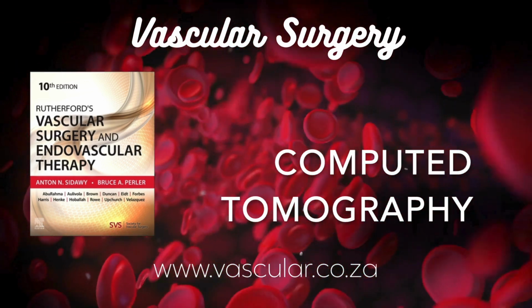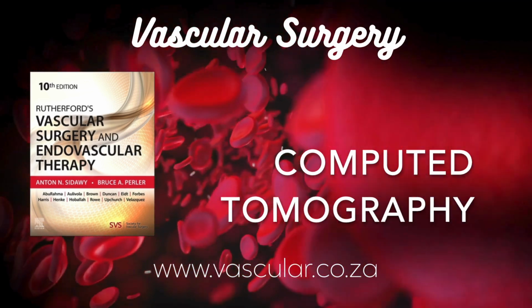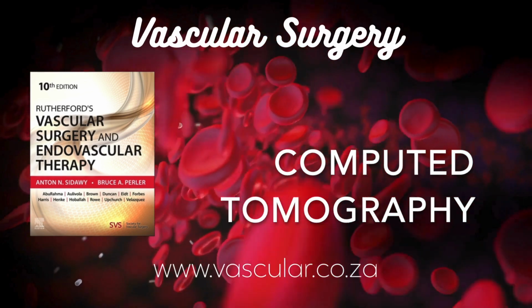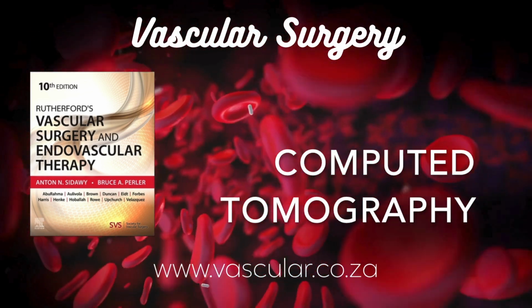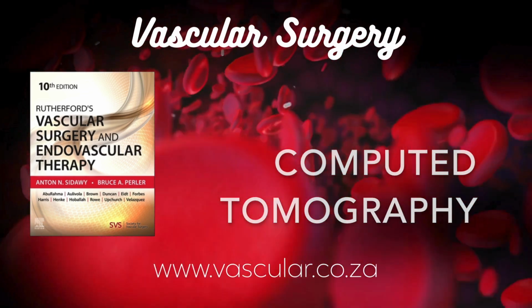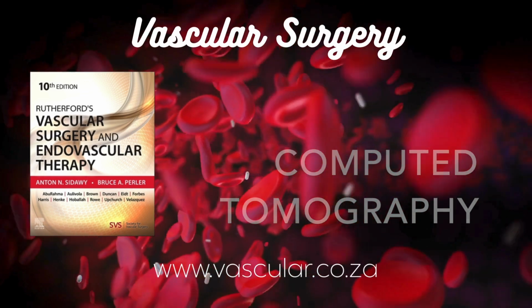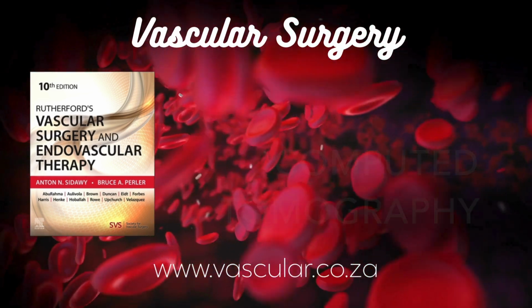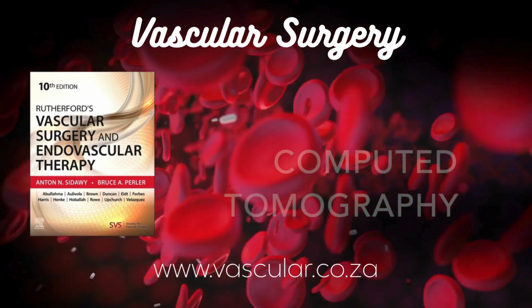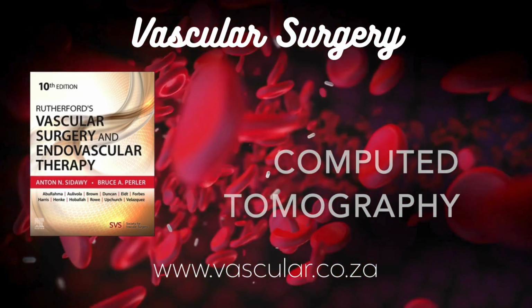Right. The key is injecting an intravenous contrast agent, usually containing iodine. Iodine is very dense to X-rays. So it makes the blood much brighter on the scan. Exactly. It significantly increases the attenuation, the HU value of the blood flowing through the vessels, making them stand out brightly against the background tissues. And this became practical with the fast scanners. Absolutely. Fast spiral and multi-detector CT was the enabler for CTA.